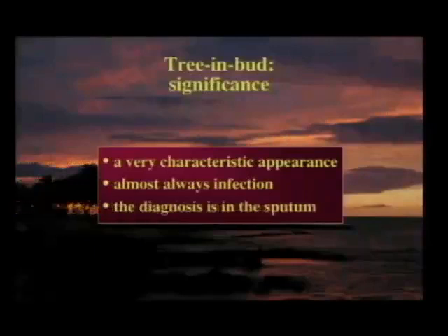The diagnosis is in the sputum. You don't have to do a lung biopsy when you see tree in bud. You have the patient spit in a cup, and then you look in the cup, and that's what the disease is.